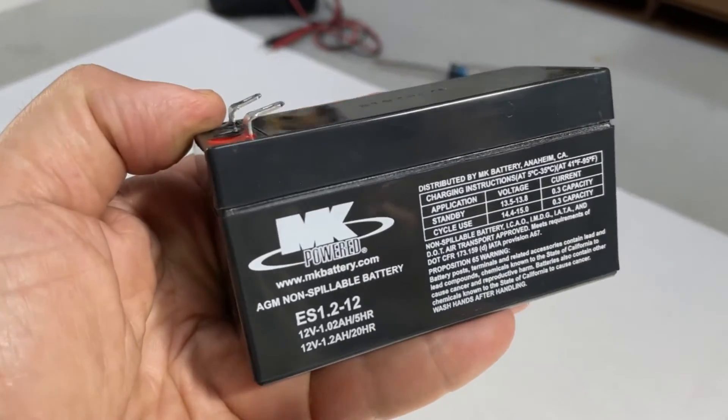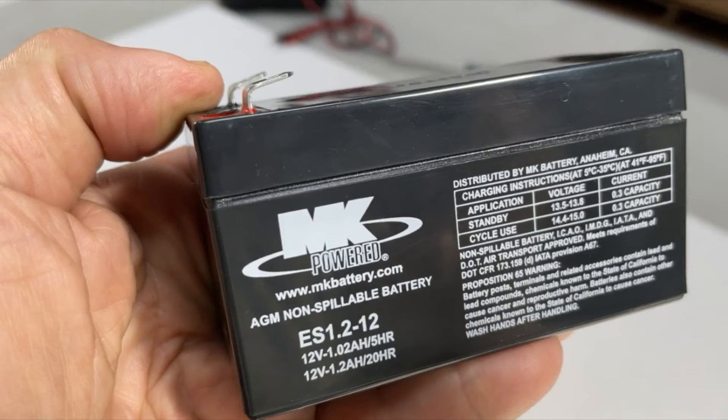The battery in the OpenSesame is a simple 12 volt, 1.2 amp hour battery. If you ever need to replace it, you can call us or get it at any battery supply store like Batteries Plus, Interstate Battery, or Duracell — though we have found those batteries don't last very long. In a pinch, you can also use a 1.3 or 1.4 amp hour battery.